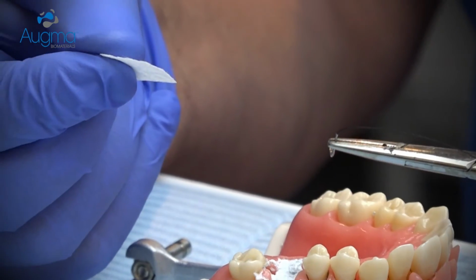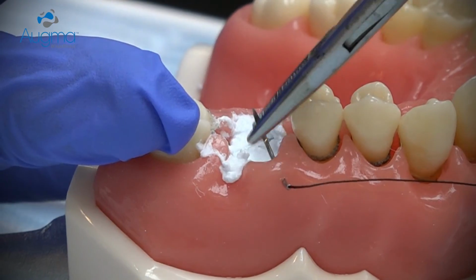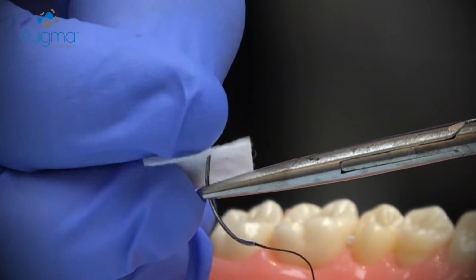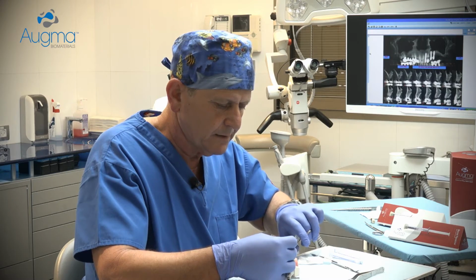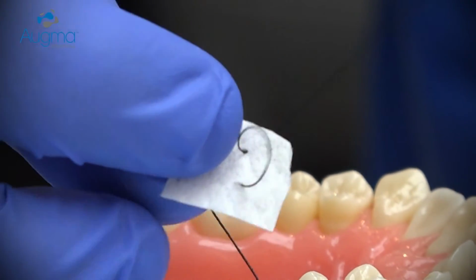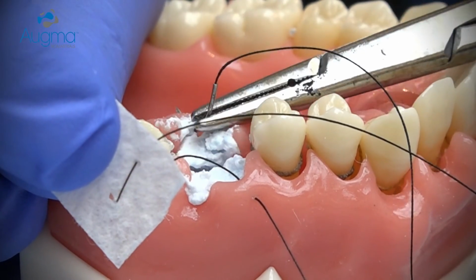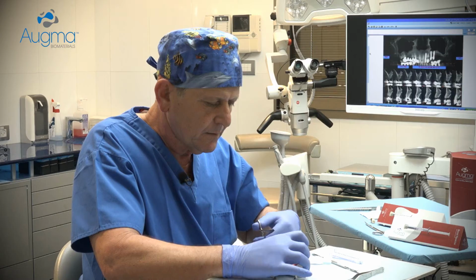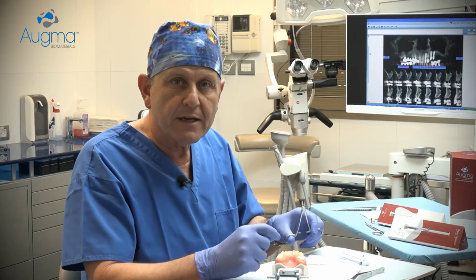So the technique is in that way. Hold the collagen sponge in your hand, insert the needle from the buccal aspect, insert it to the bottom of the collagen sponge, and from up to down, insert the needle into the lingual aspect, and place the sponge above the grafted site and make your first suture.